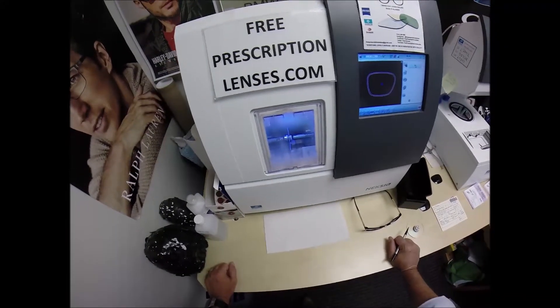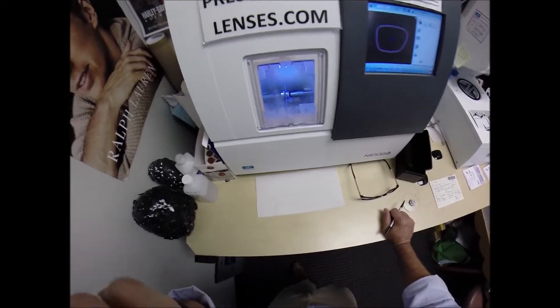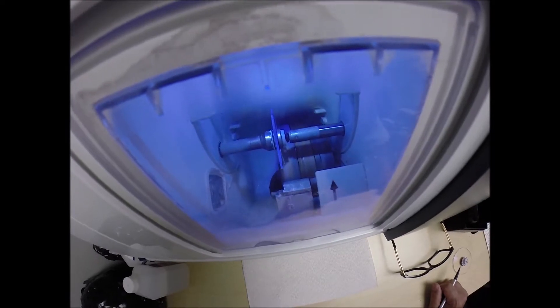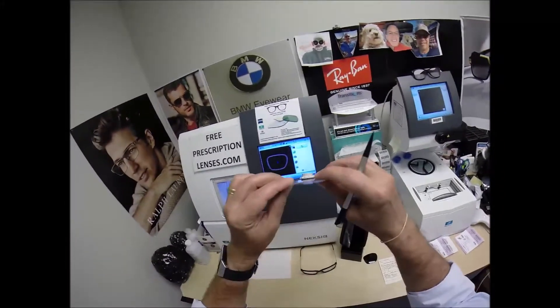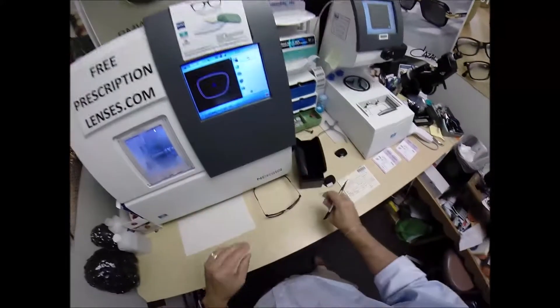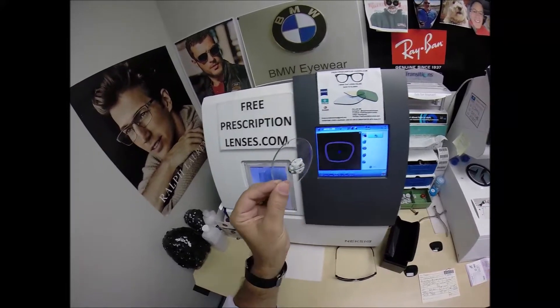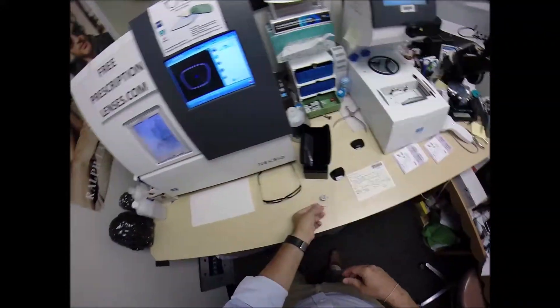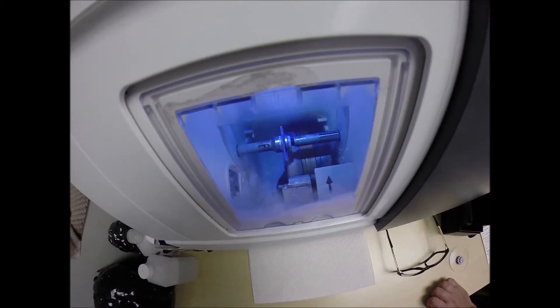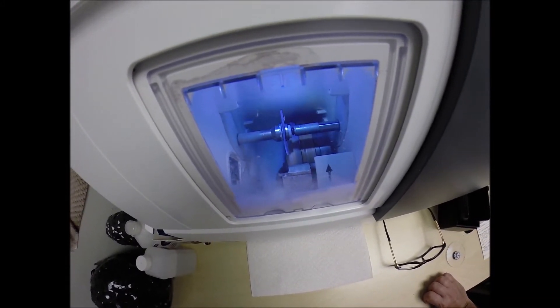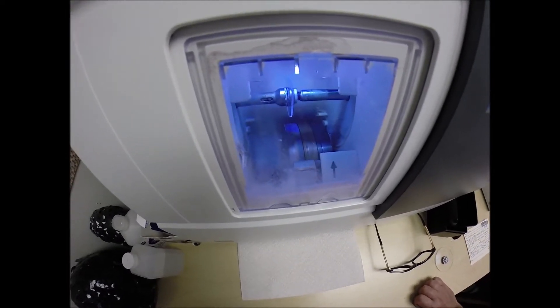Plastic, high-index plastic, and Trivex cut wet, meaning that water sprays onto the lens for the duration of the cutting cycle. Polycarbonate lenses cut dry. Water will spray onto the lens, but only for the last 20 seconds to wash away any optical debris. Polycarbonate is 40% thinner and lighter than regular plastic. It is virtually unbreakable. These are high-impact, ballistics-grade lens material.